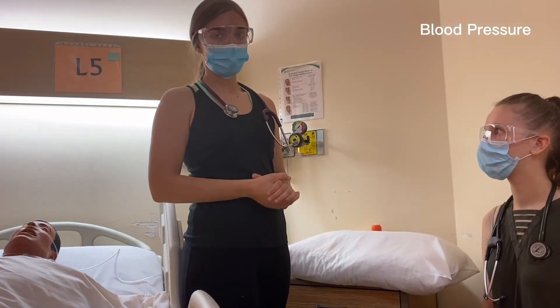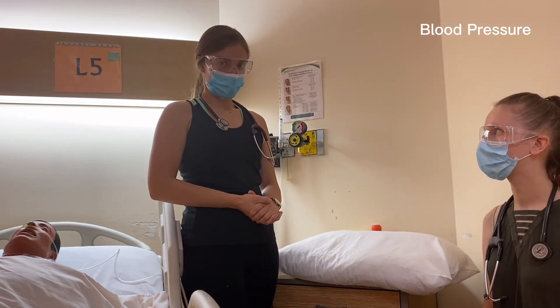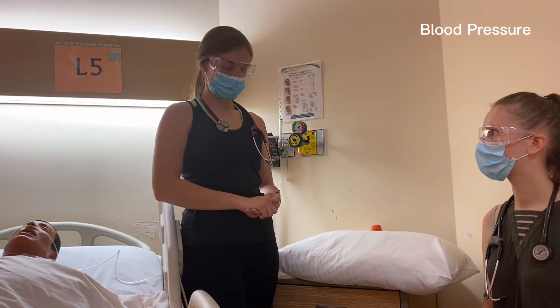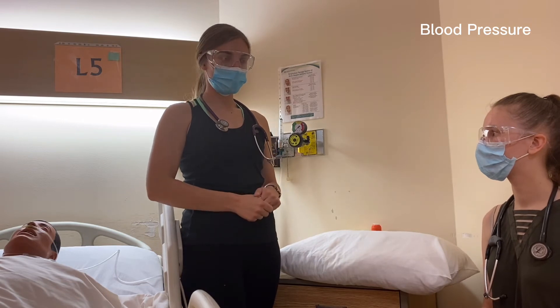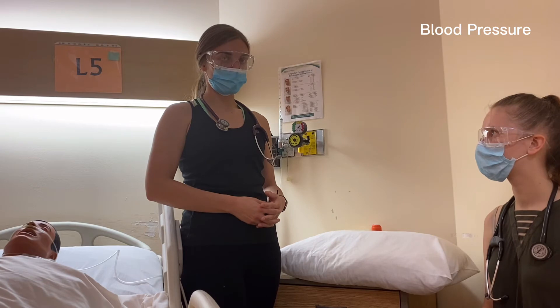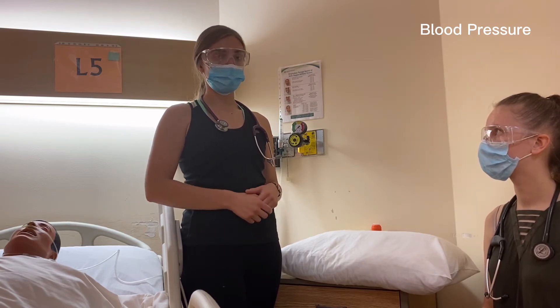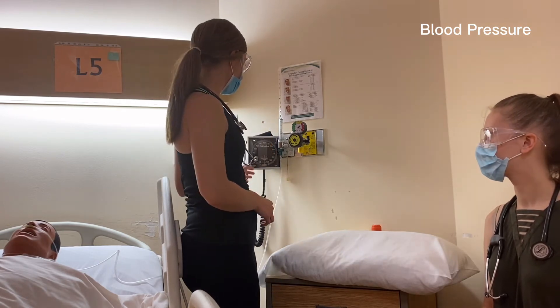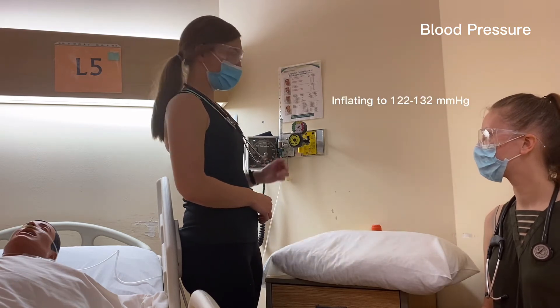For this vital sign assessment, we'll be taking the blood pressure. Prior to this, we asked if the patient was okay with getting her vitals taken — she gave permission — and we make sure she's in a comfortable position. With blood pressure, if we didn't know the baseline, we would palpate to avoid an auscultatory gap. In this case, we do know her baseline; her systolic is around 102. When we inflate the cuff, we'll be going about 20 to 30 above that. We ask her to put her arm at the level of her heart, not above, and we'll use a pillow to support that.